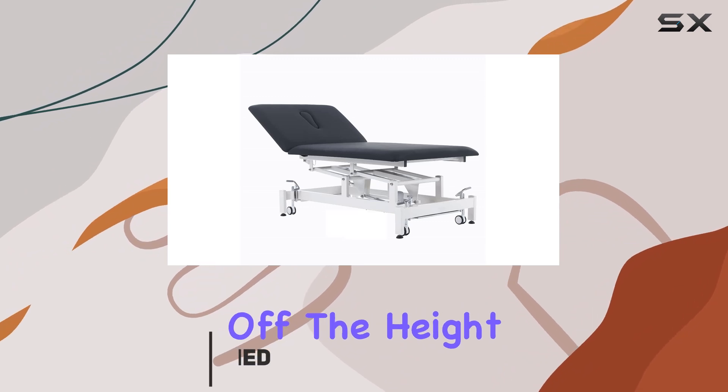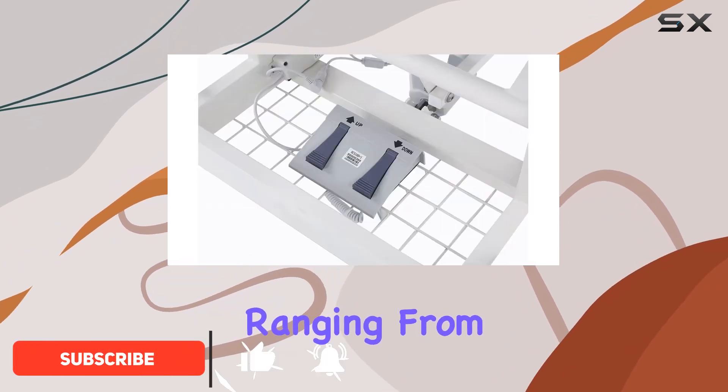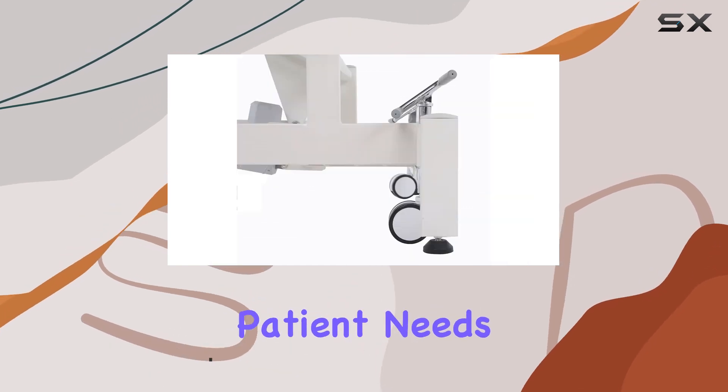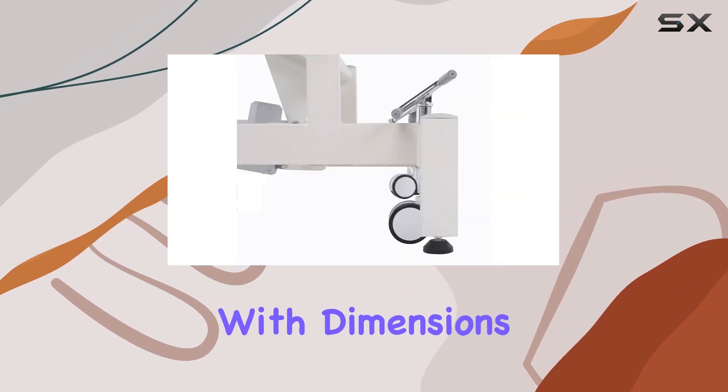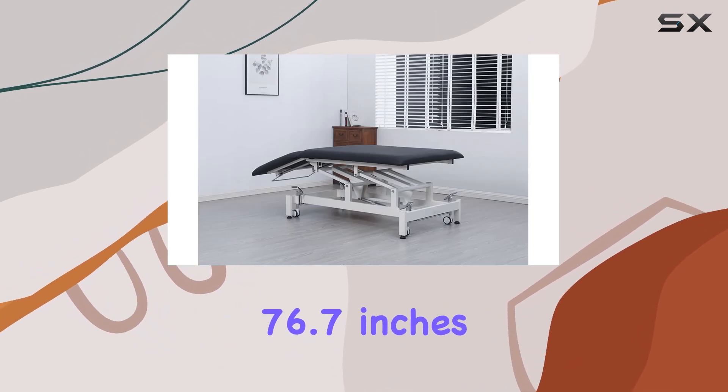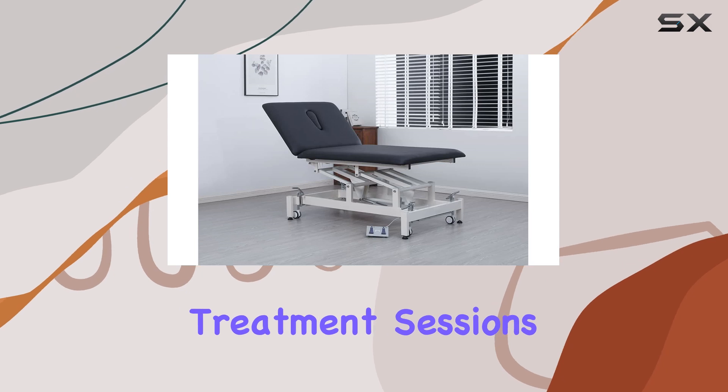First off, the height range is extensive, ranging from 18.9 inches to 36 inches, catering to a variety of patient needs. With dimensions measuring 39.4 inches in width and 76.7 inches in length, there's ample space for comfortable treatment sessions.